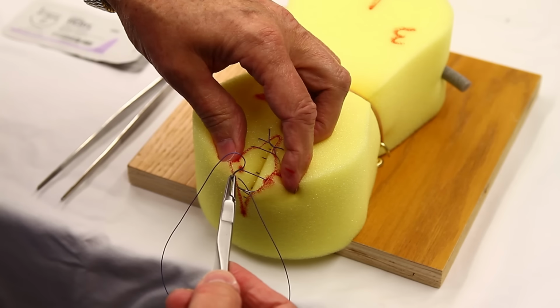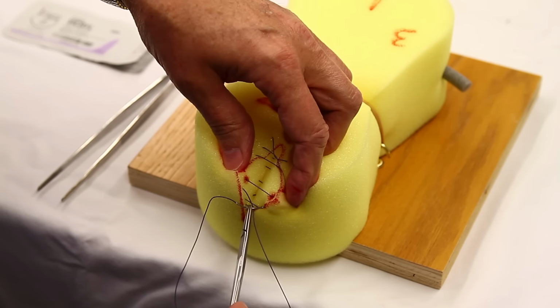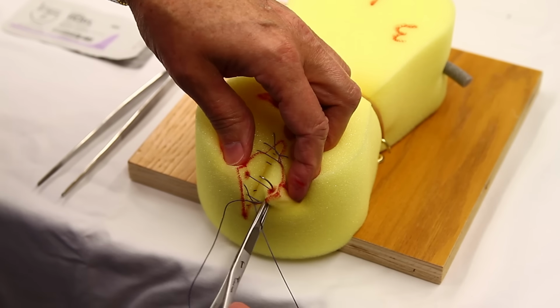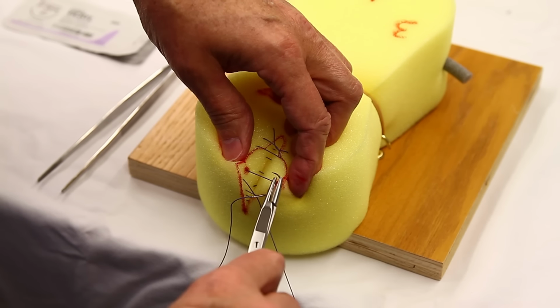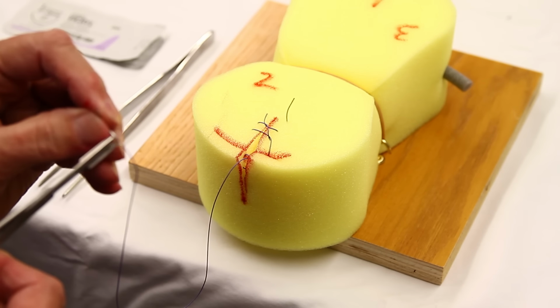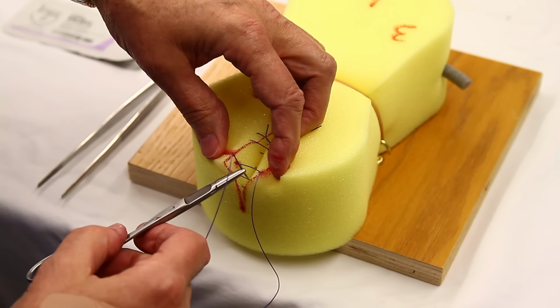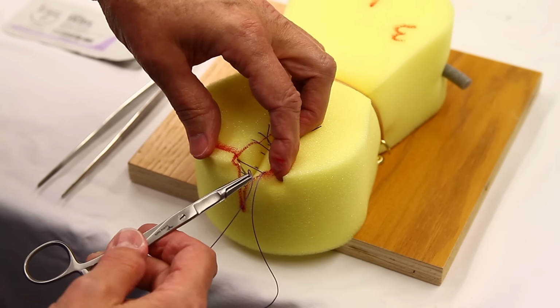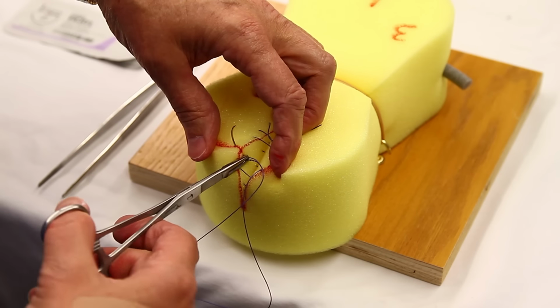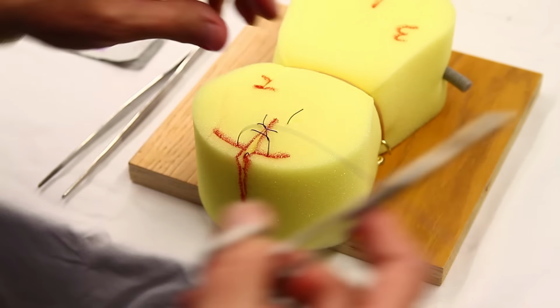And this will be our final perineal stitch. It comes out right near the perineal body, close to that other stitch. Carry it through. And now we're going to transition back into the vagina. So go right across through that to that perineal stitch, come out the hymen. You're right on the hymeneal line now. Now we're back inside the vagina.